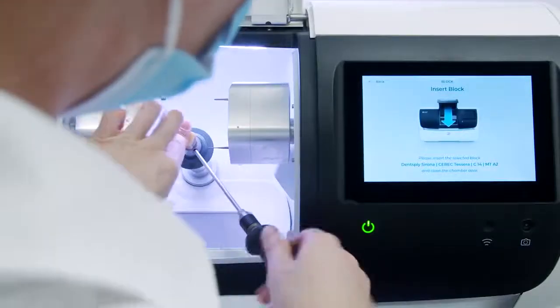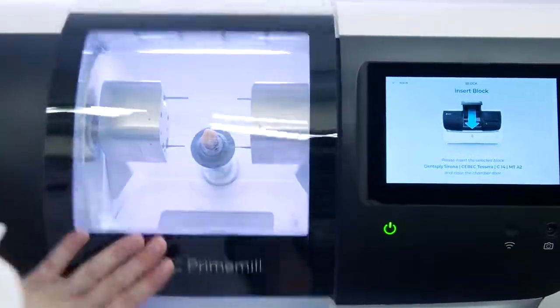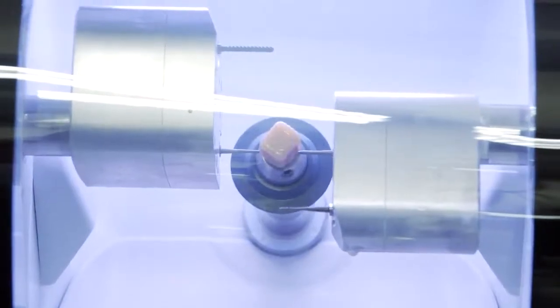The Cerec Ticera block is then placed in the block holder in the usual manner to start the milling process. Grinding processes matched to the material are prepared in the Cerec's prime mill and ensure optimum results.